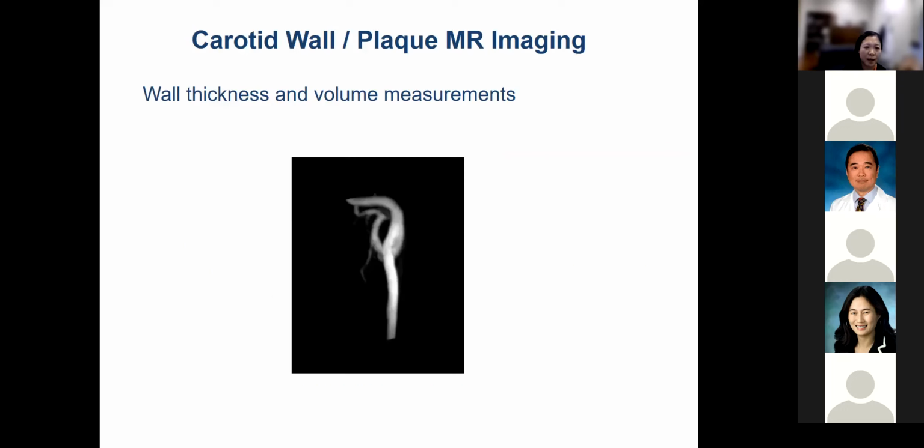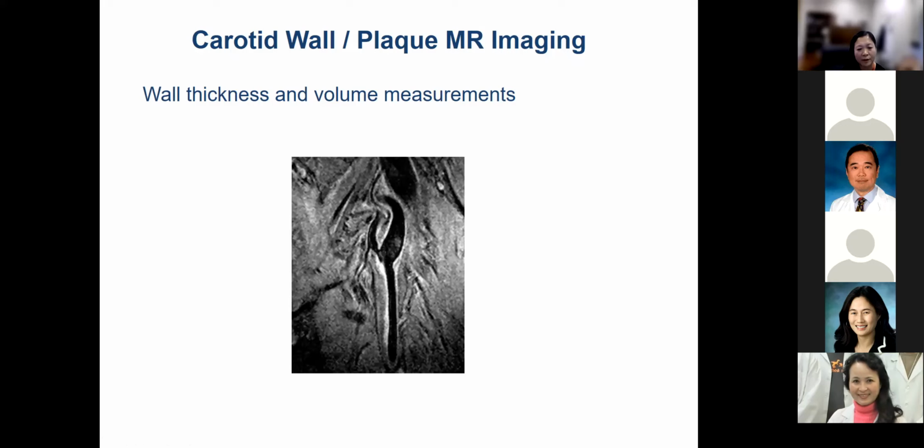Before we move to intracranial MRI vessel wall or lumen imaging, we have extensive experience in carotid imaging, because the carotid is superficial and it's also relatively easy to assess the pathology specimen. So that is where we first started.